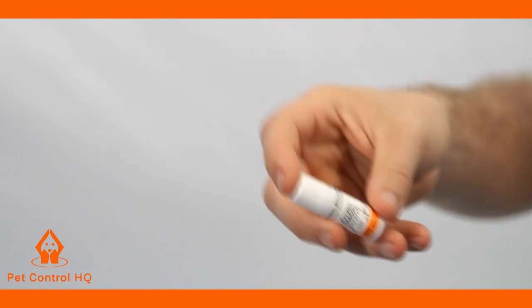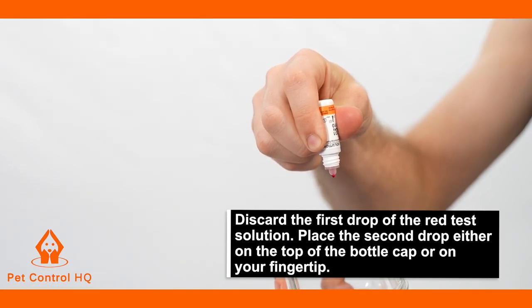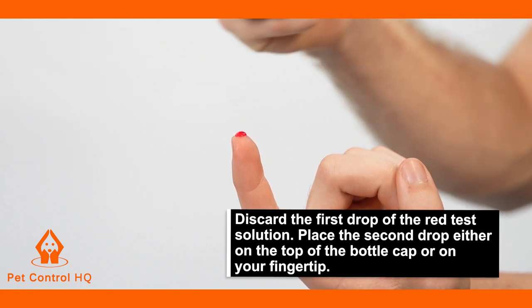Shake the control solution thoroughly before use, and then discard the first drop of the red test solution. Place the second drop either on the top of the bottle cap or on your fingertip.